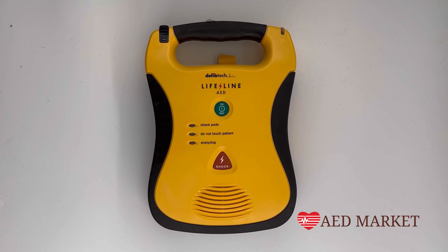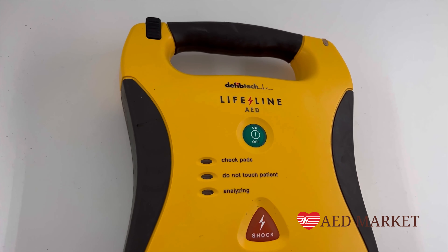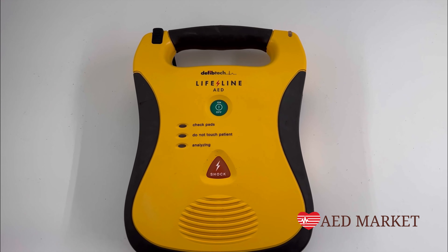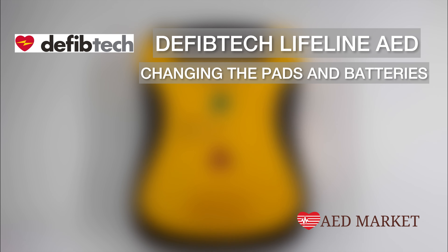This video is presented by AEDmarket.com, and in today's video we're going to guide you through the process of changing both the pads and batteries for the DefibTech Lifeline AED.